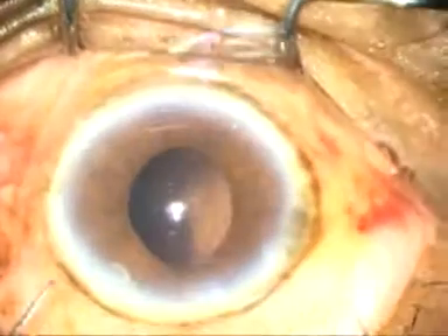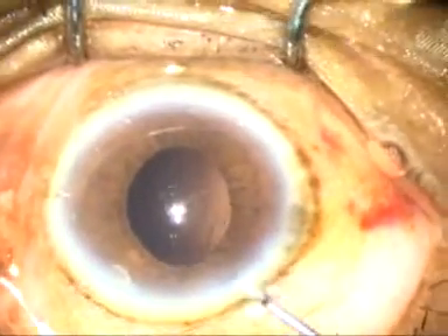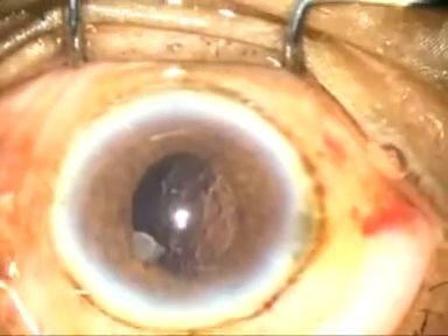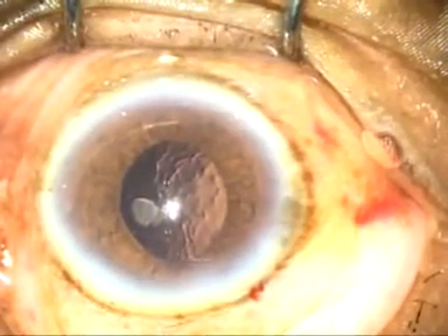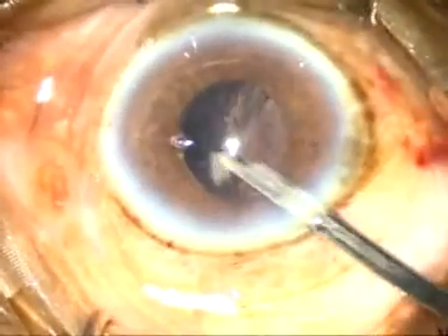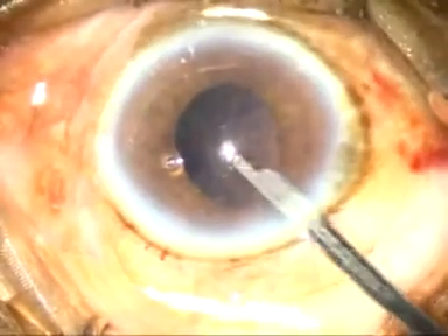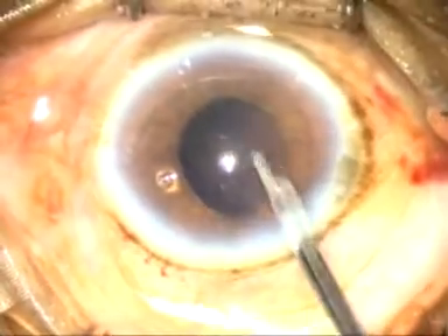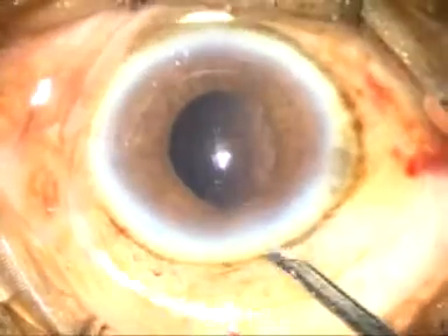There is a small nuclear fragment just in front of the left side port. I push this nuclear fragment and escort it out by a Simcoe cannula. This has to be done first, before aspirating cortical matter, because we don't want to lose this nuclear fragment somewhere under the iris.